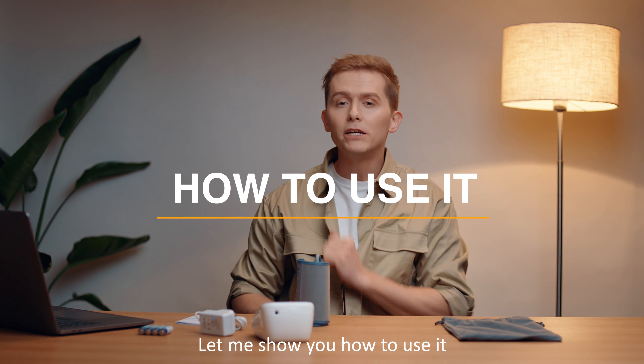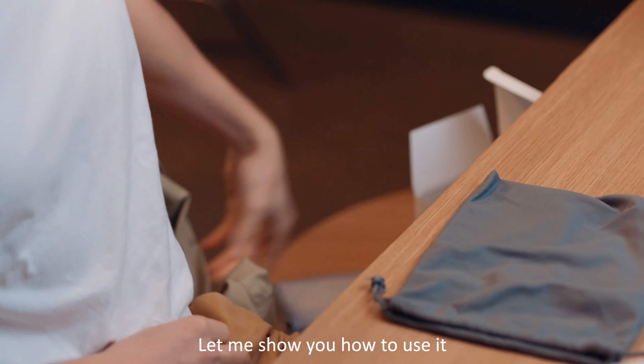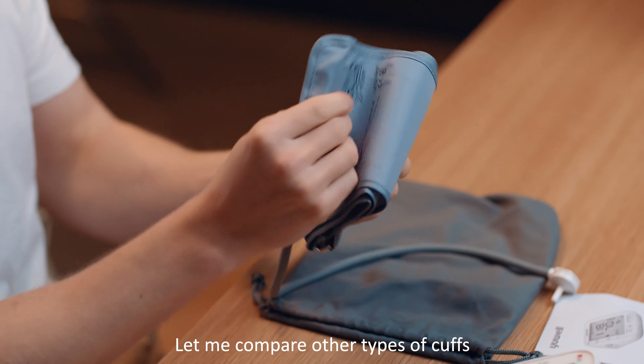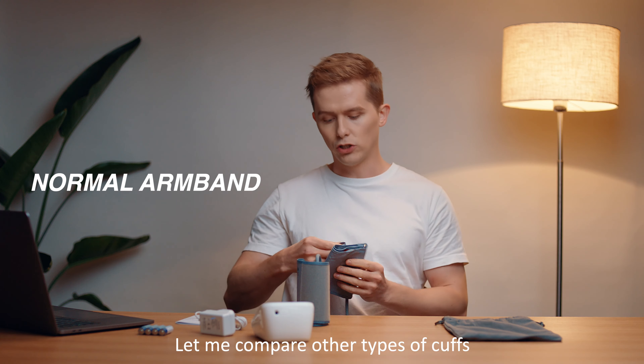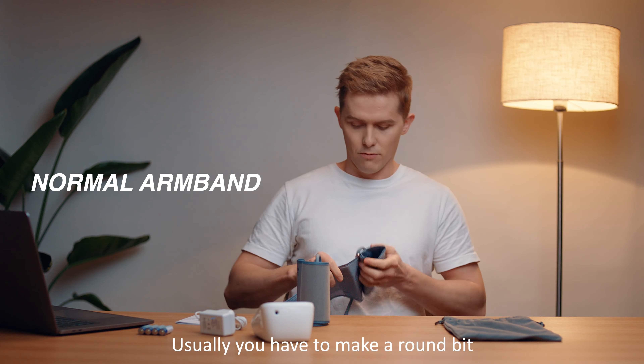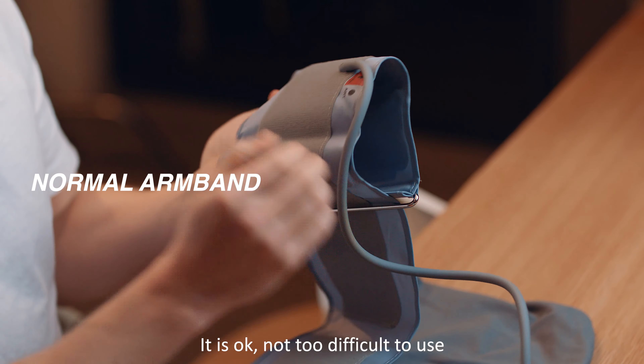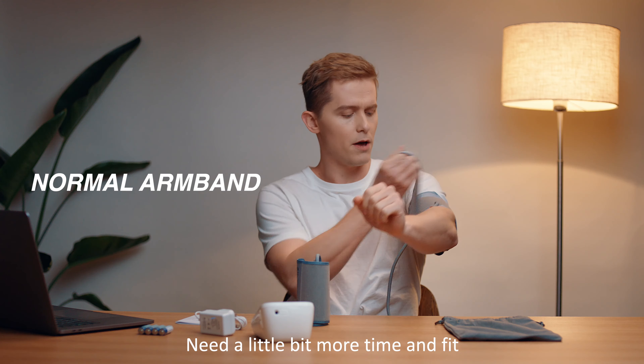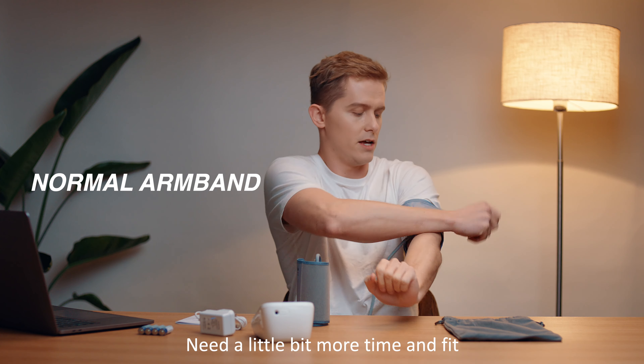Let me show you how to use it, but first let me quickly compare it with other types of cuffs. Usually you have to wrap them around a bit — it's okay, not too difficult to use, but it takes a little more time and the fit isn't quite as good.